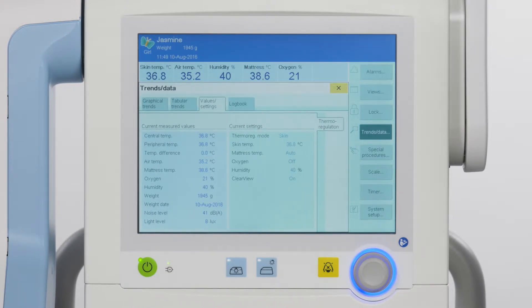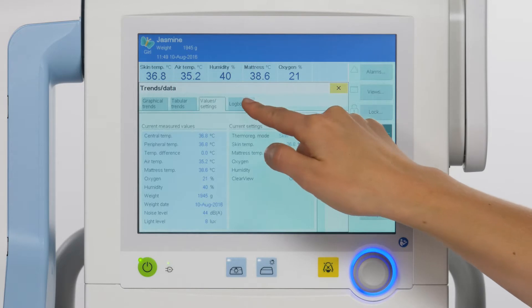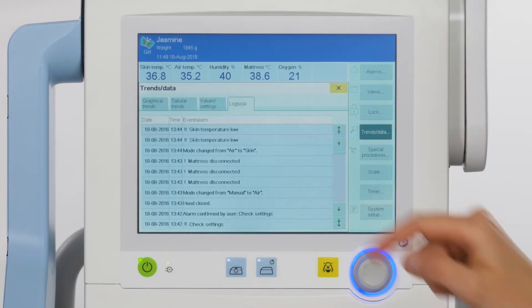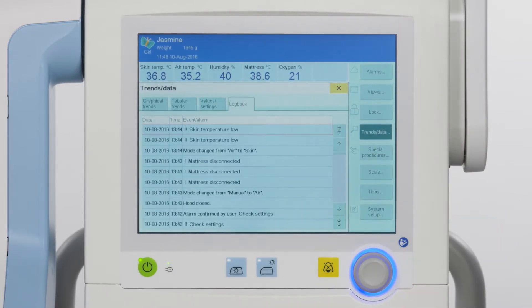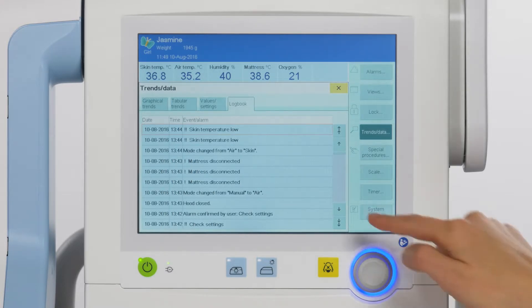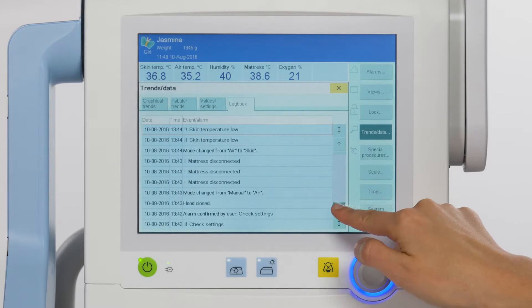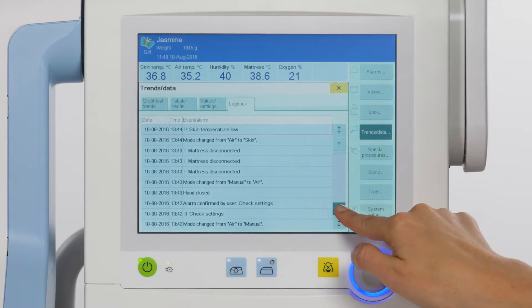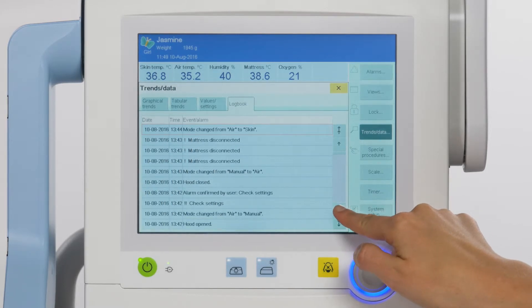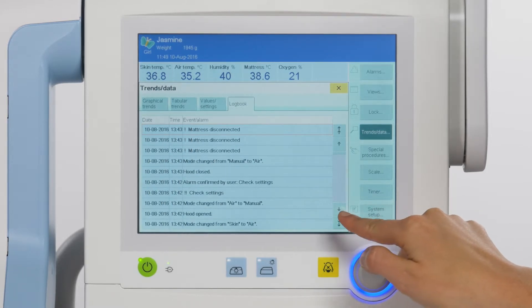The fourth tab is the logbook. The logbook tab displays all events and alarms in chronological order. The latest event or latest alarm will be seen at the top. Scroll to show earlier events and alarms using the arrow keys.